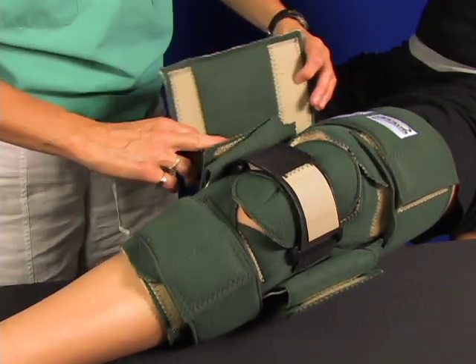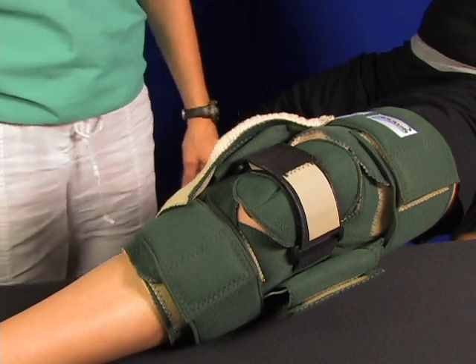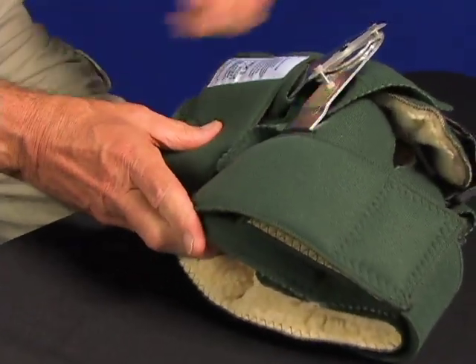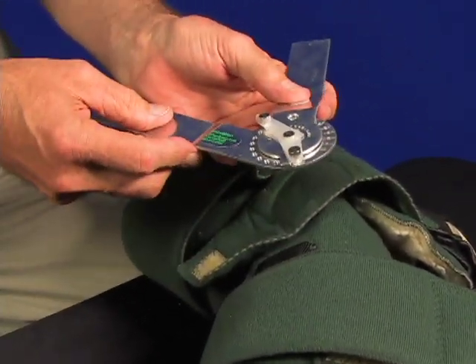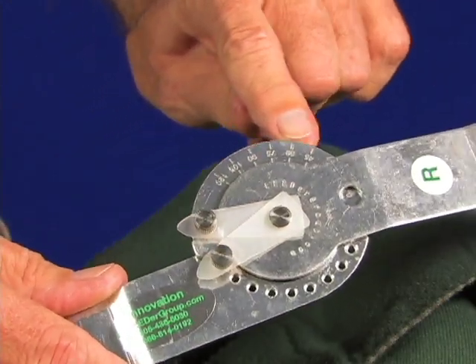Here's an adduction pad to protect the other leg basically from any contact with that metal hinge. Add extra protection there. Here's a close-up on the hinge in the splint. This applies to the elbow and the knee. You can see the hinge, this one is now adjusted open for complete range of motion.